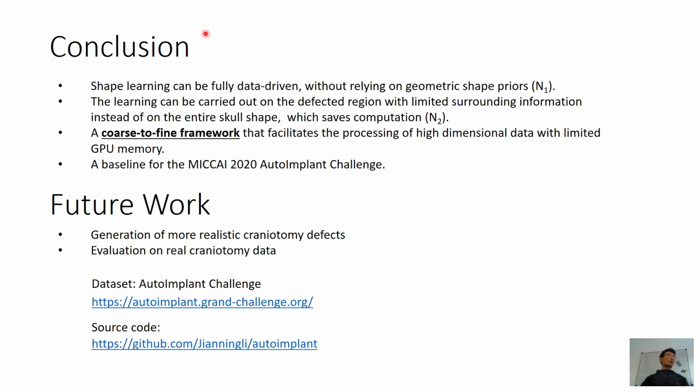To conclude, our study has 4 contributions. First, we demonstrated that high-resolution shape learning can be fully data-driven without relying on geometric priors. Second, to save computation, shape learning can be carried out only on the defected region with limited surrounding information, instead of on the entire skull. Third, most importantly, we propose a coarse-to-fine framework that facilitates the processing of high-dimensional data with limited GPU memory.